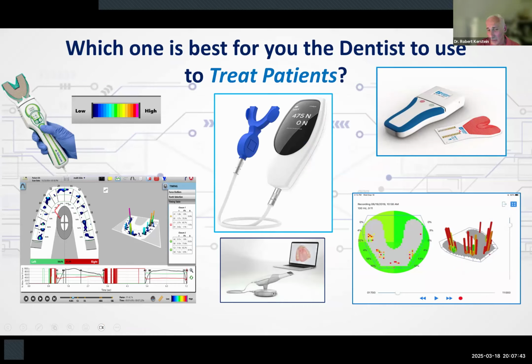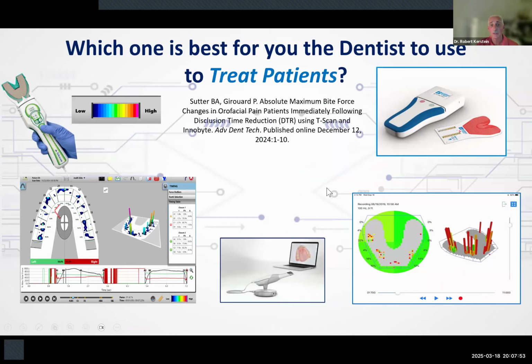So initially, I showed you them all. Well, InnoBite, you really can't treat patients with. You can only monitor success or failure in improving someone's bite strength. For example, in this study, the T-scan was used to treat patients' occlusions after the patients were initially recorded with InnoBite.